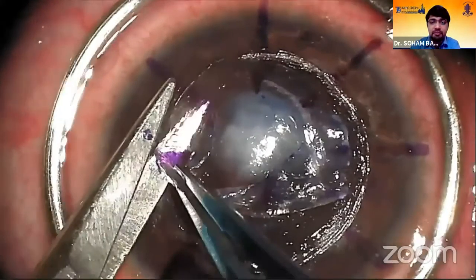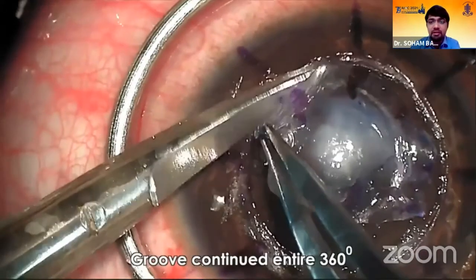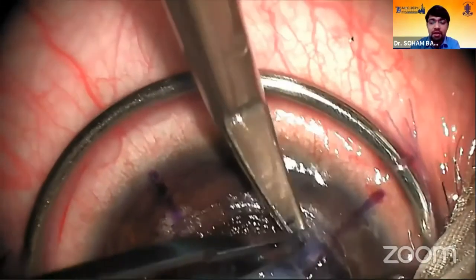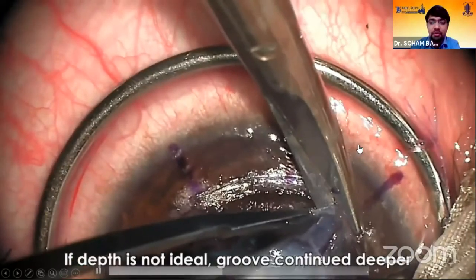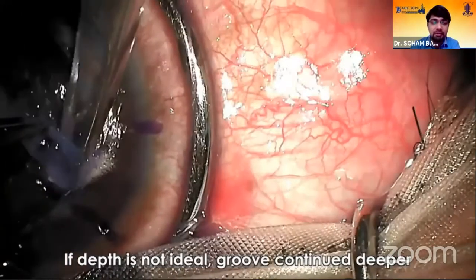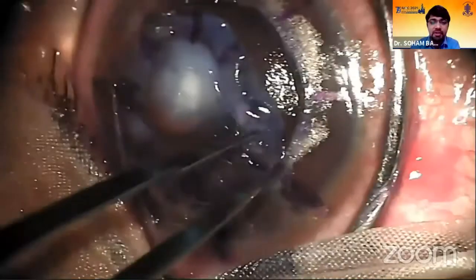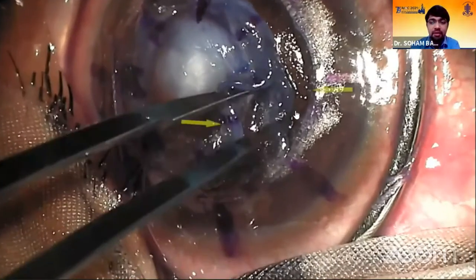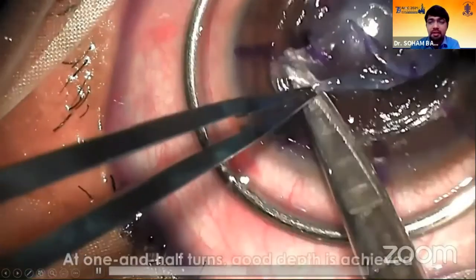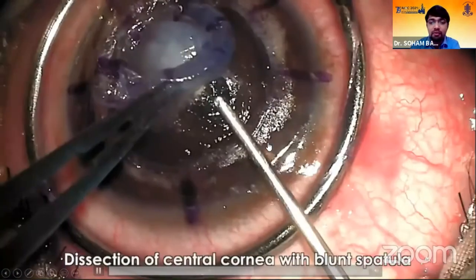So you do not want the inadvertent corneal perforation. And make sure whenever you're doing any step of dissection or the snipping action, the blades are as horizontal as possible. So sometimes after one round of the groove, if you are not happy with the depth, go in a spiral fashion and do a groove the second time. So here you can see the two layers, the superficial layer, which I did initially, and now the deeper layer, which I'm doing. The iris details from the underlying stromal residue give you an idea of how deep you have gone.